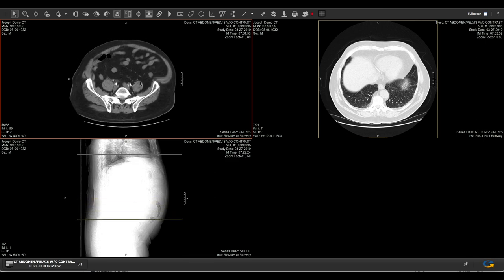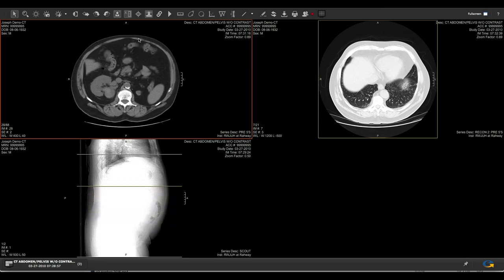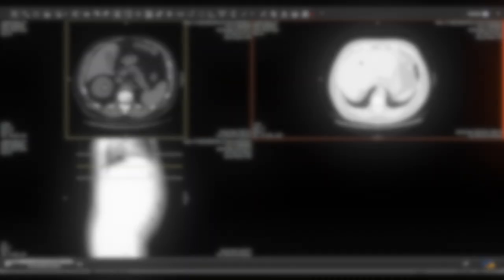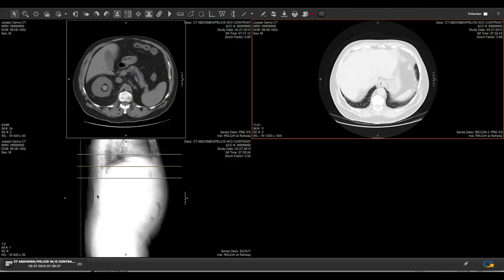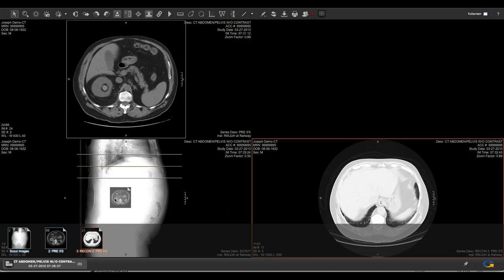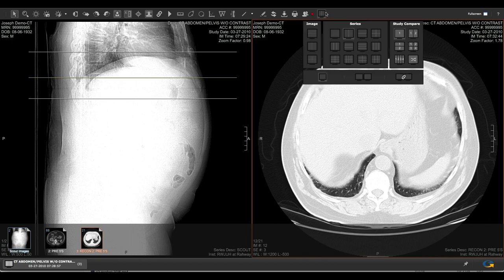Many medical imaging studies include hundreds and even thousands of images, and are usually organized into what we call series. To access all the series in your study, click on the series tray at the bottom. Each series can be arranged on the display by dragging it to the desired window. If you prefer a different window arrangement, the Screen Layouts tool allows you to customize it.